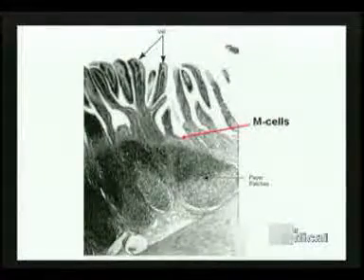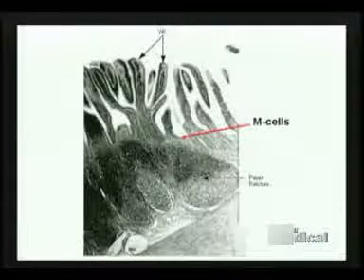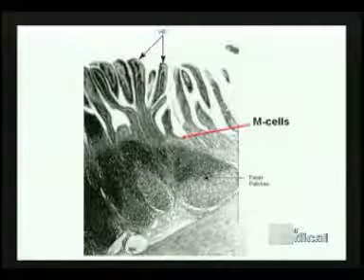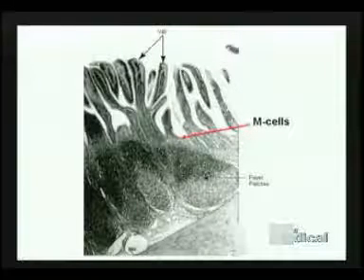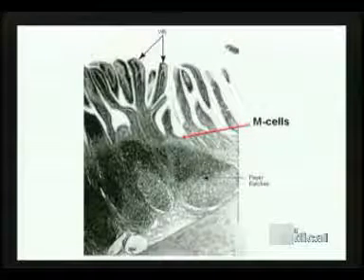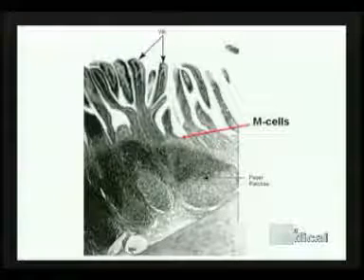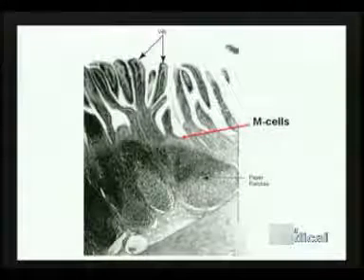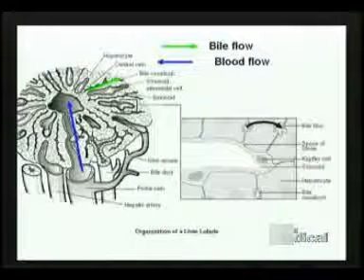Let's move now to a section in the notes that illustrates a section through the ileum, and the reason we know it's ileum is not, again, the presence of the villi and the crypts, but the presence of prominent patches of lymphatic tissue containing B cells and the related germinal centers in close proximity to the luminal epithelium. Even though we can't distinguish it histologically, that luminal epithelium is characterized by the presence of microfold or dome cells, the antigen-presenting cells intermingled among the adjacent columnar enterocytes at the level of the Peyer's patches.